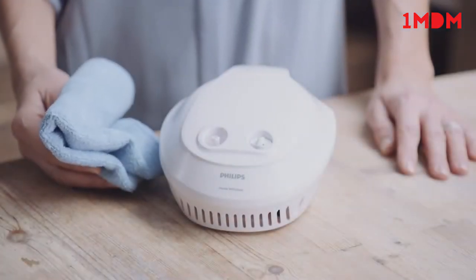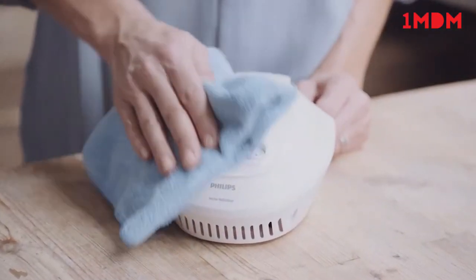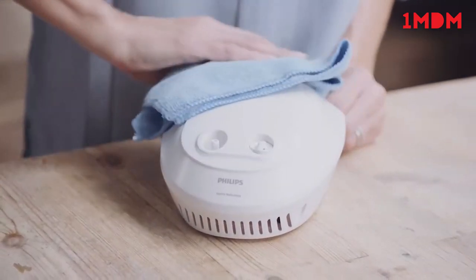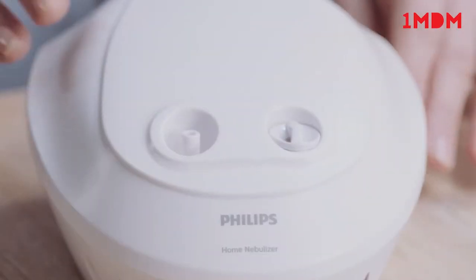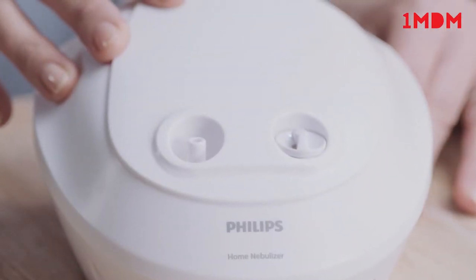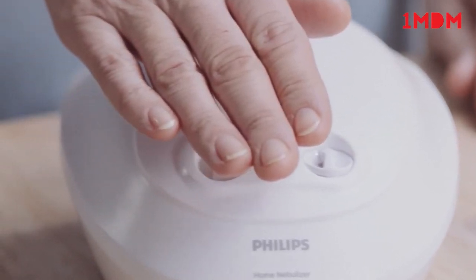Always unplug the unit before cleaning. The device can be cleaned by wiping down the outside of the compressor with a clean damp cloth. Do this at least once a month. After cleaning, make sure the unit is working properly by checking that air still comes out of the nozzle when the unit is turned to the on position.